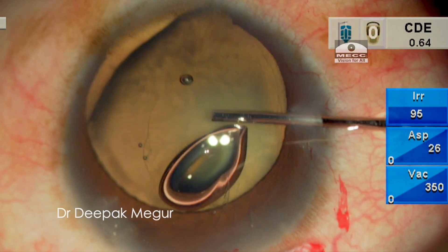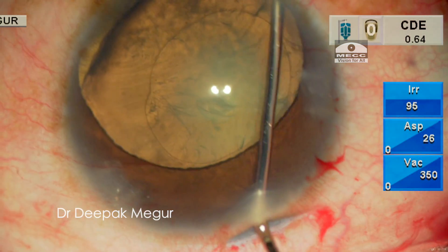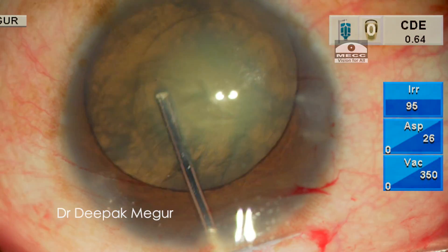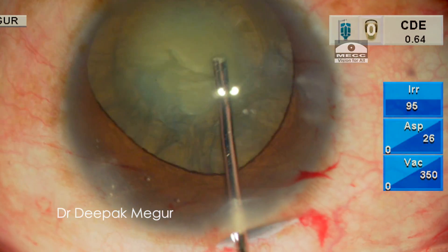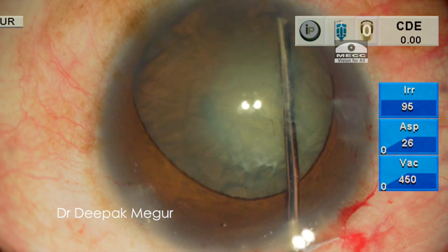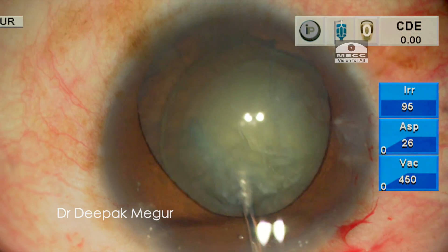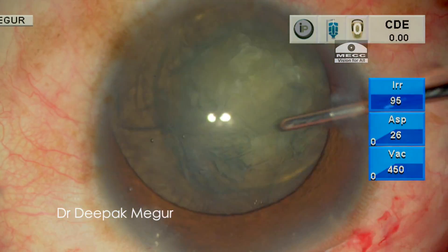The next most critical step in such eyes with compromised zonules is to get a perfect cortical cleaving hydrodissection. I can see the posterior fluid wave and it confirms the occurrence of a good hydrodissection. I gently tap the opposite quadrant to let out the trapped fluid and confirm that the nucleus is freed from the attachments with the capsular bag. I'm also performing hydrodelineation, hoping that it would be less stressful on the zonules while managing a small nucleus. I gently rotate the nucleus to confirm that it is free from any attachment.